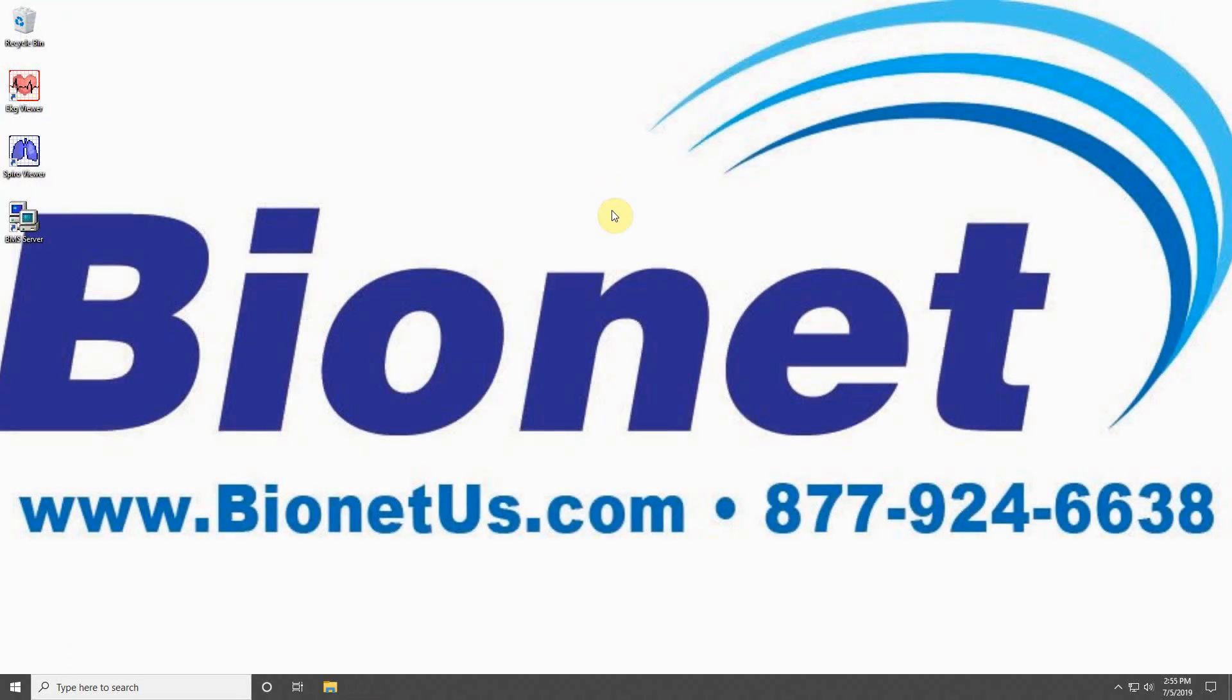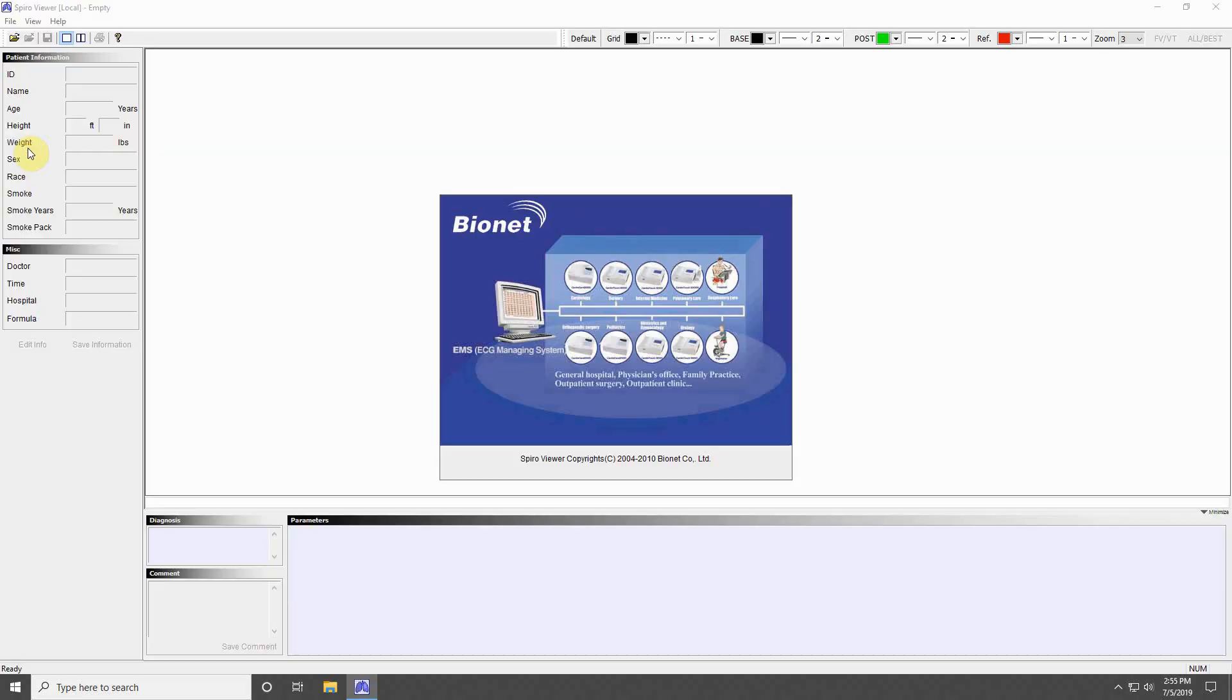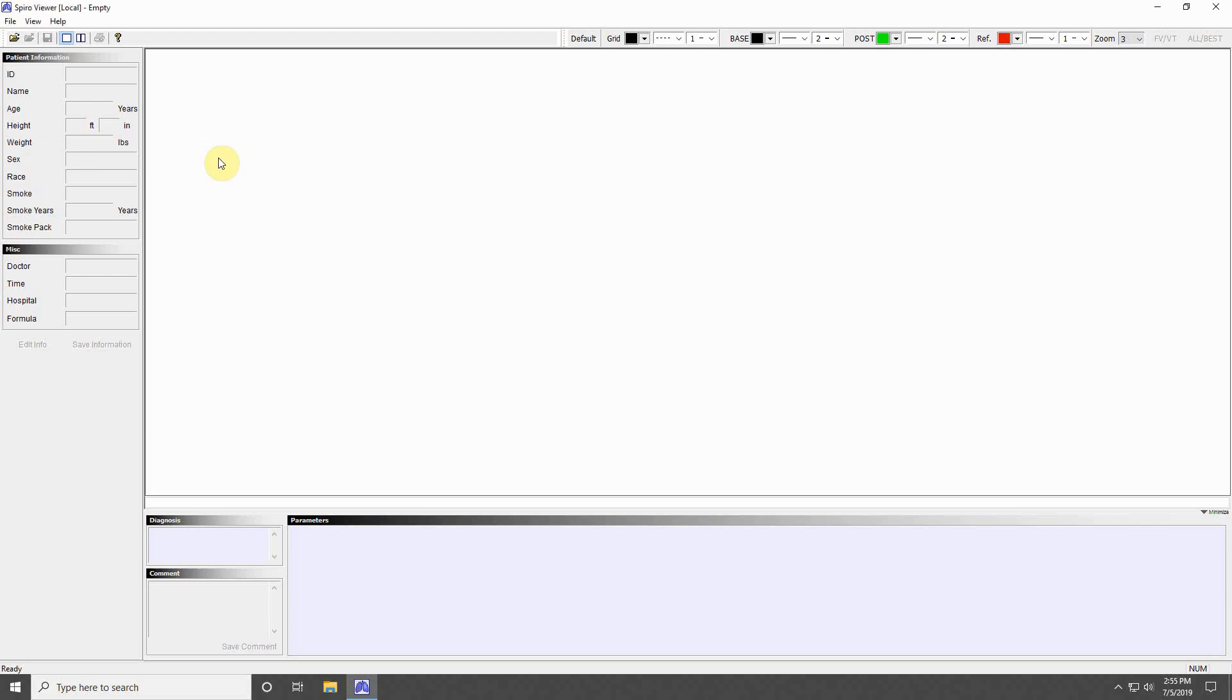The final program that is included with BMS Plus is the Spiro Viewer program. Once again, this program can be launched by double-clicking the desktop icon, or launching it from the BMS server list. This program will look very similar to the ECG Viewer program, but with a few small differences.